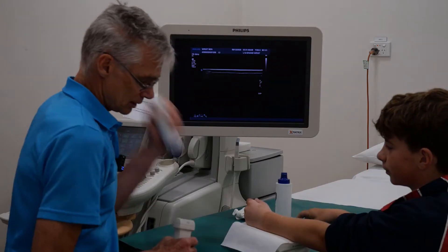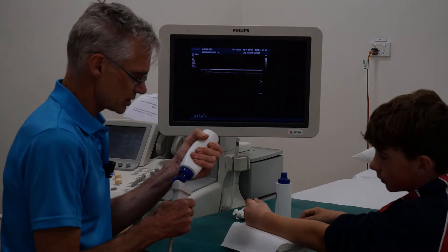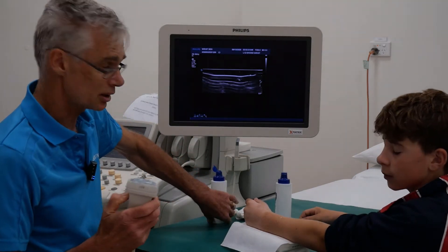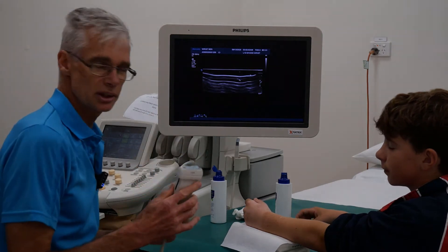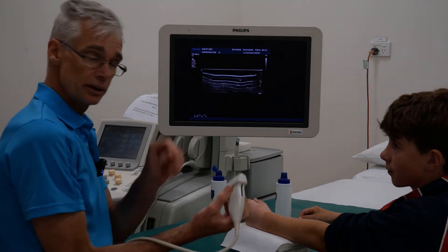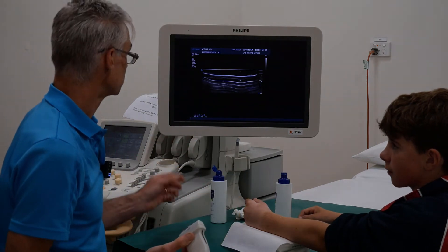All we want to do today is just check how the angulation is — has it increased, is it the same? Sometimes even a bit better. And maybe to some extent check the healing as well. We've just come out of the cast today and we generally use scan to check the position and to some extent the healing at three weeks for these sort of buckle slash greenstick type fractures.